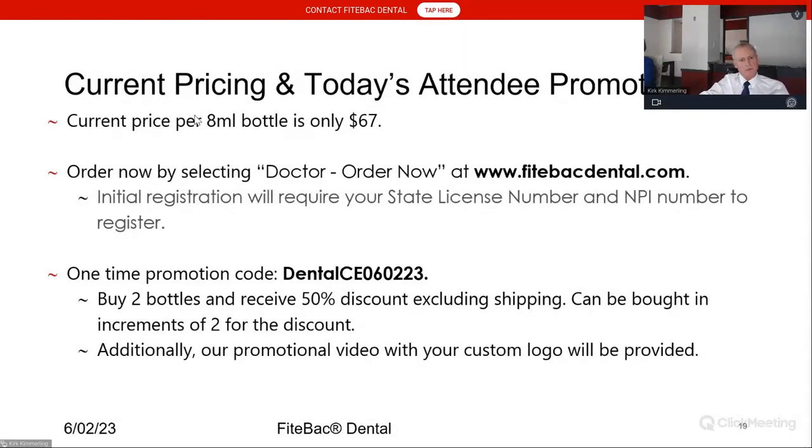And again, this is not an expensive material to use. In fact, as I practice, we basically put a drop on the brush and rub that one drop into the dentin of the tooth. You might use a couple drops, but I'm trying to teach you how to conserve the material, rub it on the enamel and the dentin, much like Dr. Comisi explained. And again, I don't do much air drying. We recommend you put your bond agent of choice over top of the cavity cleanser and rub deeply. The slide I showed before, drying the ethanol away, was to show people that there's really something in the bottle. And that layer shows how pronounced it is, how much you're going to be putting on the dentin of the tooth.